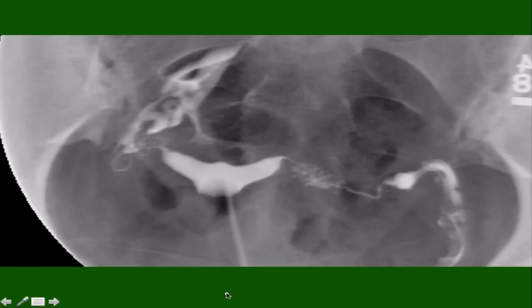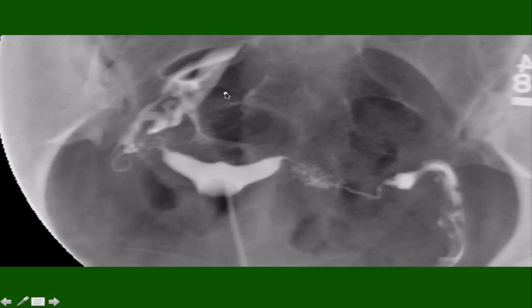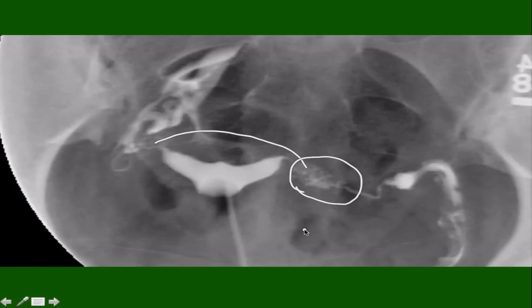Here is another normal HSG. You can see that dye has spilled from both fallopian tubes. There are two interesting findings: the top of the uterus has a slightly different shape than what we've seen before, but this would be considered a normal variant. Second, we see an area in the isthmic portion that looks a little stippled. That is a sign of a condition called salpingitis isthmica nodosum, or SIN, which has been associated with infertility and subfertility.